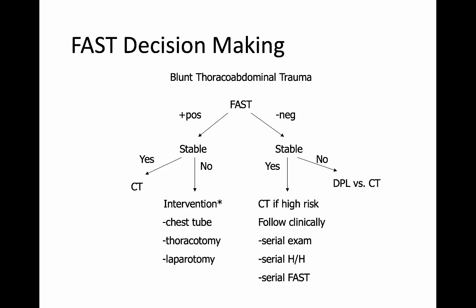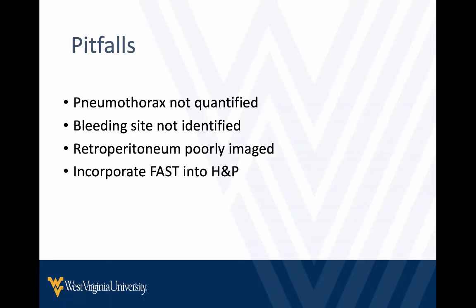If they've got penetrating trauma and they're stable, then the FAST exam may help you identify earlier fluid in the abdomen, fluid in the chest, fluid around the heart, and again, just help you tailor your decisions and work through the decision making in that patient with a little more information than you would have just with history and physical alone. So remember the pitfalls, we talked about these.